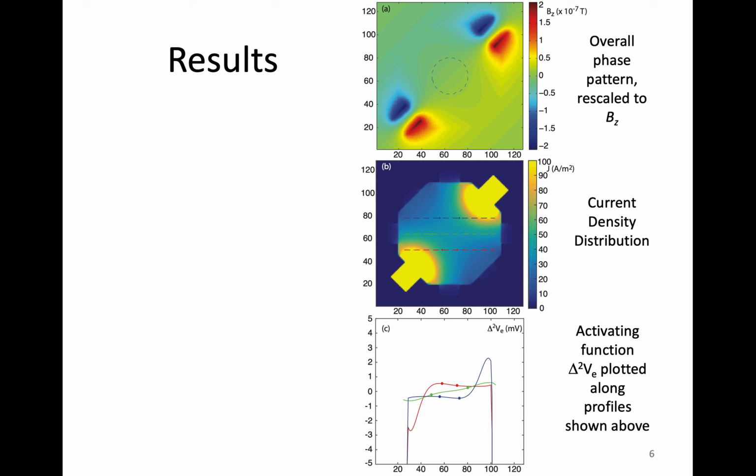Because we are also interested in the effect of the imaging current on activity inside the tissue model, we also plotted the current density distribution caused at the peak of the imaging currents. This measure can broadly be used to predict how likely it is that activity will be caused.